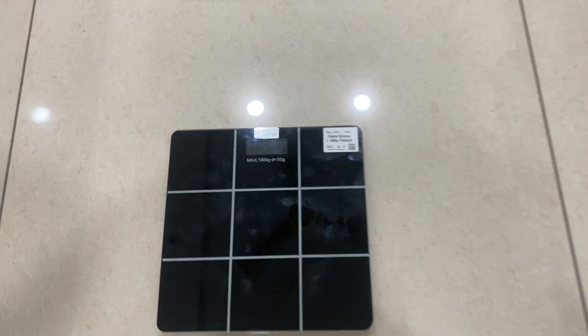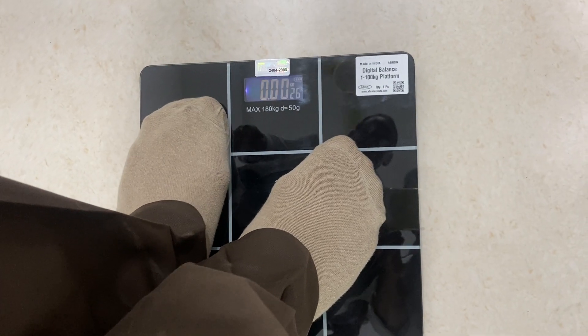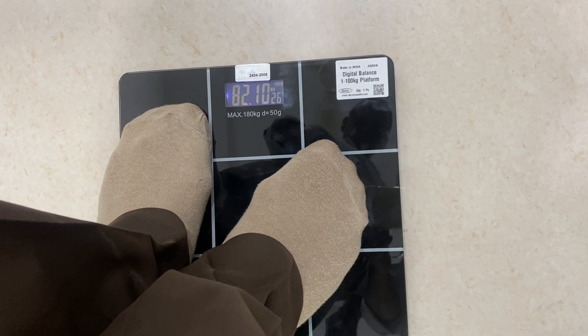When you stand up on the balance, it will immediately start working. You can see now it is showing 82.40 kg and 26 degree temperature.